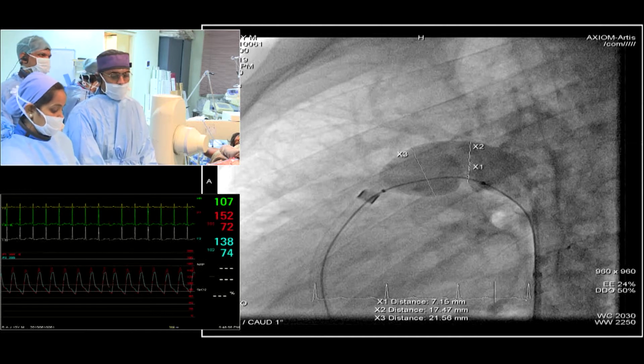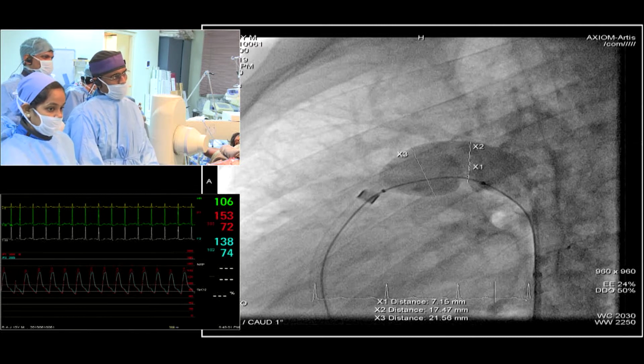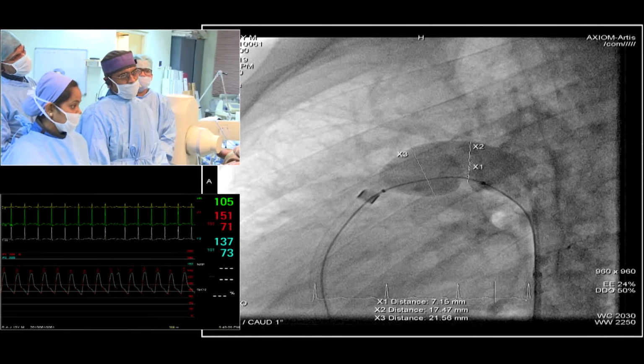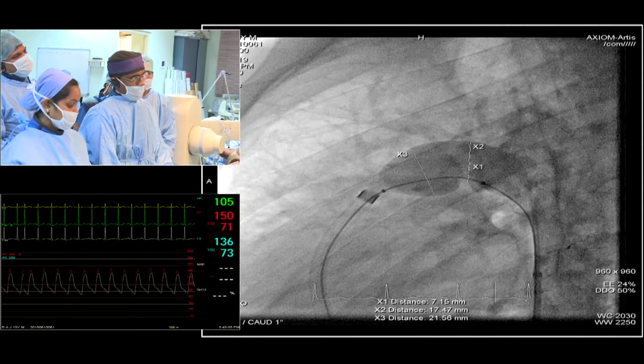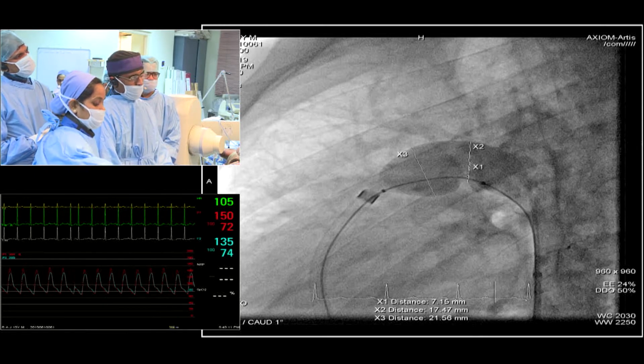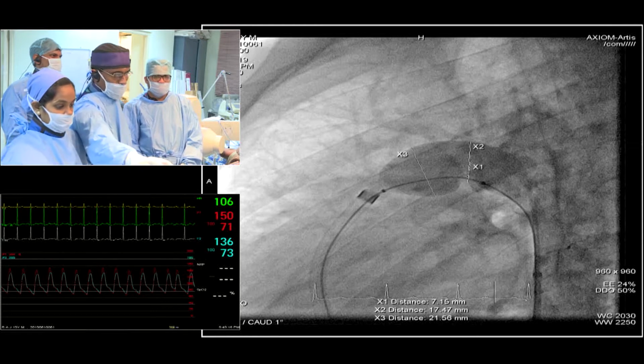That's what Joe's saying. What is the diameter of the balloon just proximal to the indentation? It's a 22 millimeter Tyshak balloon. Is that an inflated diagonal diameter or a vertical diameter? The vertical diameter is 21.6. Right, I would go for a 22 post-infarct VSD device.